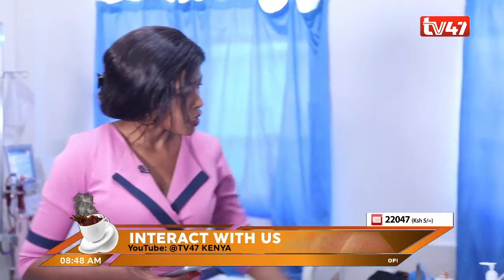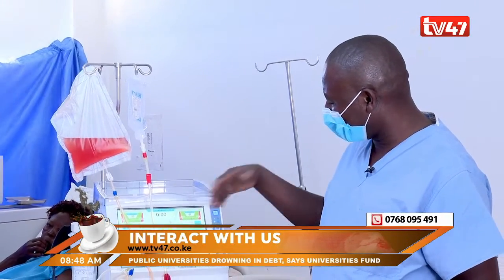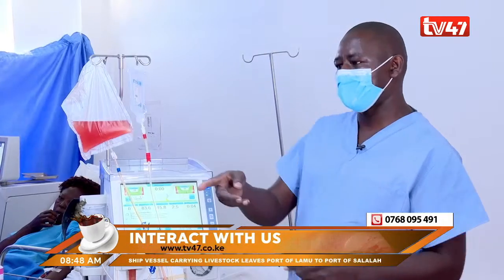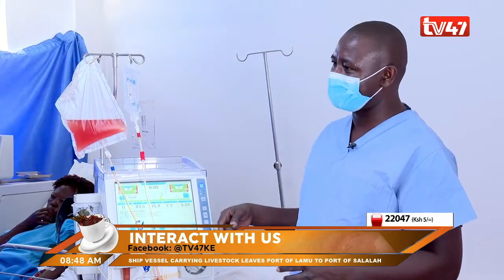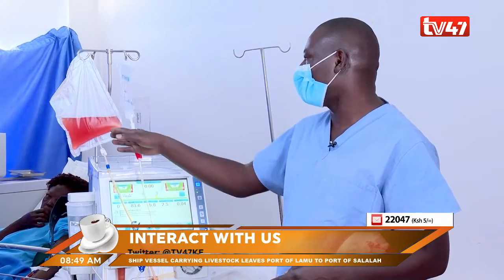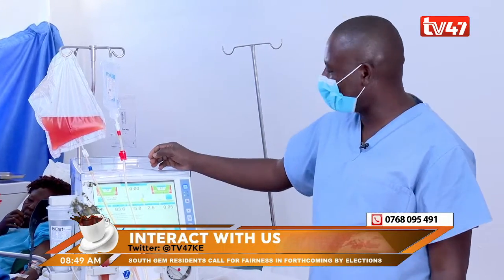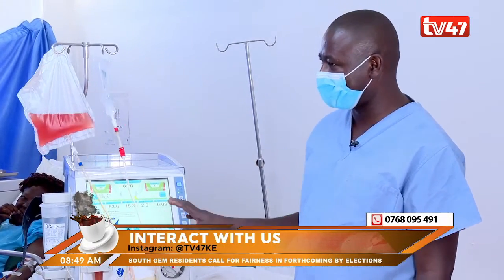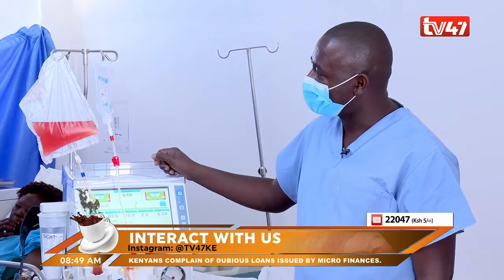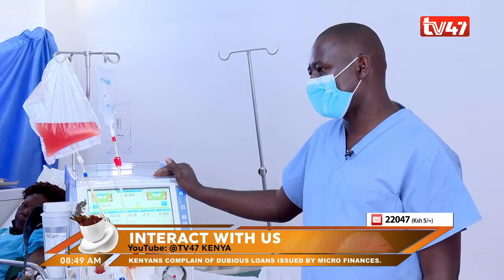What is this that looks reddish? After the patient has finished the dialysis, we do what we call a retrans — we return the blood back to the patient. So this is the color of blood inside these pipes. The other clear lines are saline. So this is the cleaning process — we are finishing now. I am supposed to remove these lines, and then they are cleaned differently from the disinfection process. We have the service for that.